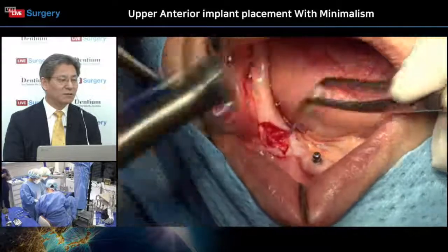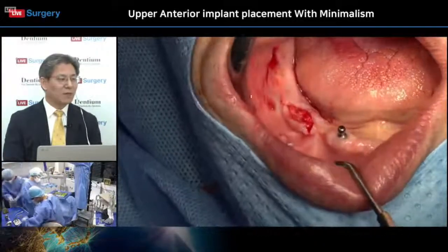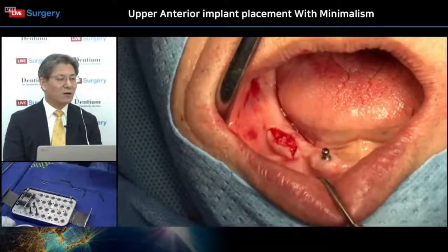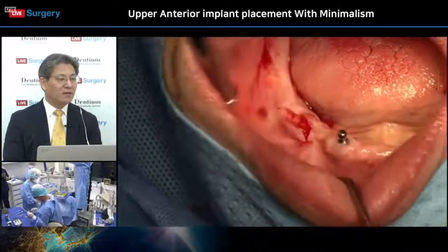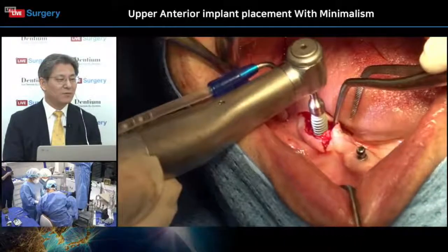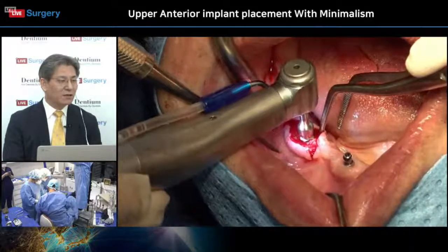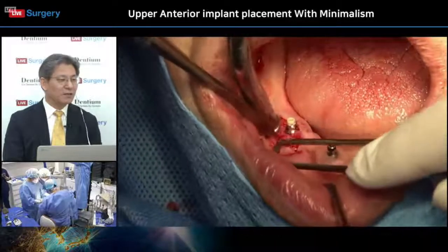So I will place the 9 millimeter. It's a little bit deeper. Okay. Yeah. He made the osteotomy site 11 millimeter depth and a 9 millimeter fixture installed. So a 2 millimeter slightly deep insertion, that was planned. So this one is a tissue level implant.